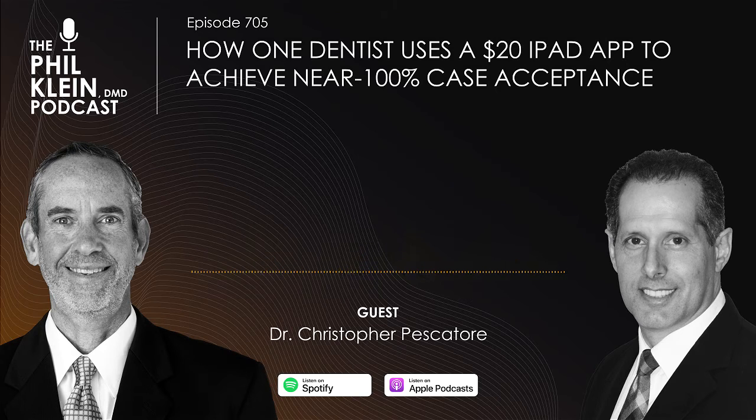Well, first off, I'm not making a final restoration with it. I have to make that clear. This is for your digital diagnostic wax up. The whole point of this is to build that patient rapport, that patient buy-in, the confidence. But within that program, within the course, what I teach is how you can actually simulate prep models. So you can actually simulate prepping it in this application.